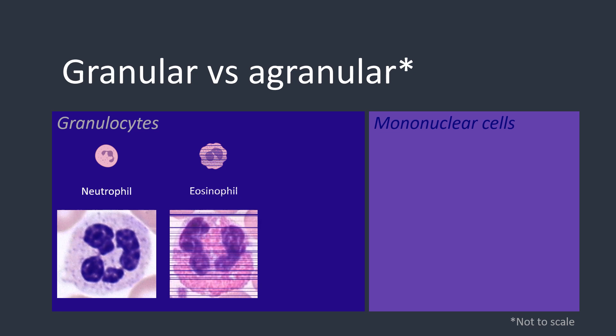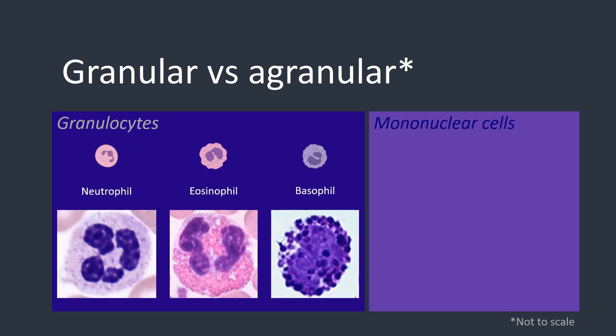Next up we have the eosinophils. Their nucleus normally has two to three lobes, but just like the neutrophil, it can be hypersegmented or hyposegmented in certain conditions. The most distinctive feature is the reddish-orange granules within the cytoplasm — the granules are larger than those in the neutrophil and spherical in shape. The last cell in this category is the basophil, which has deep purple, almost black coloured granules that cover the nucleus. For all three of these cells, changes in granulation can be seen in different conditions.